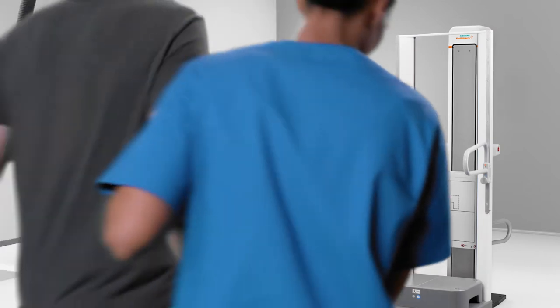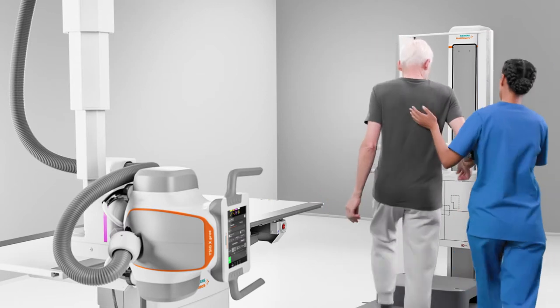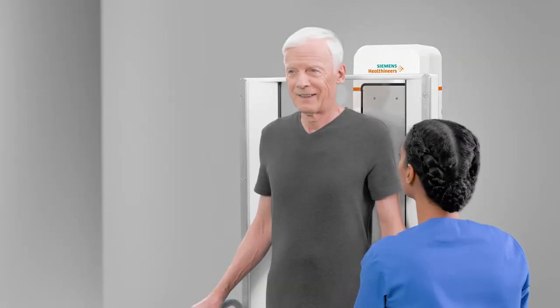Imagine you could reduce complexity for long leg and full spine examinations. Smart Virtual Ortho smoothens the preparation of orthopedic exams and improves patient comfort.